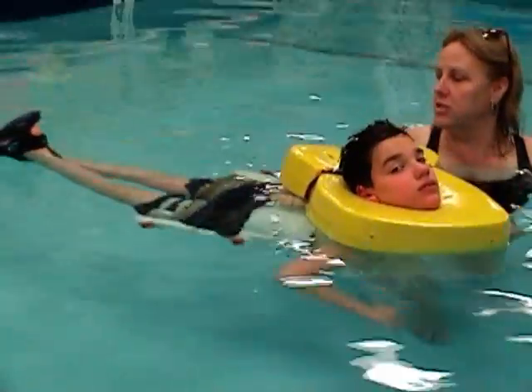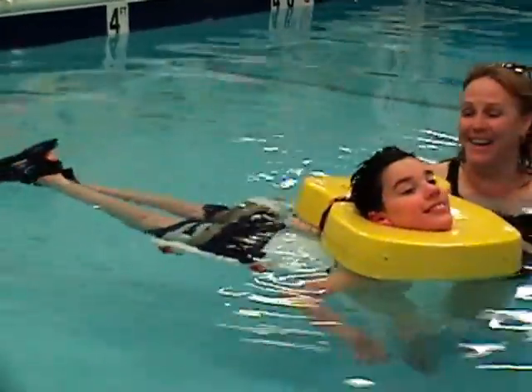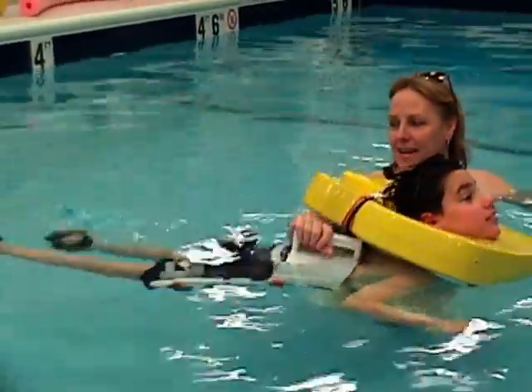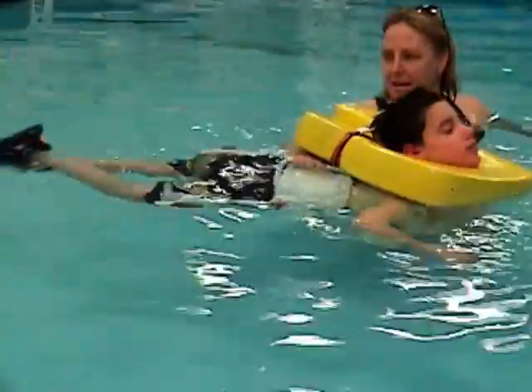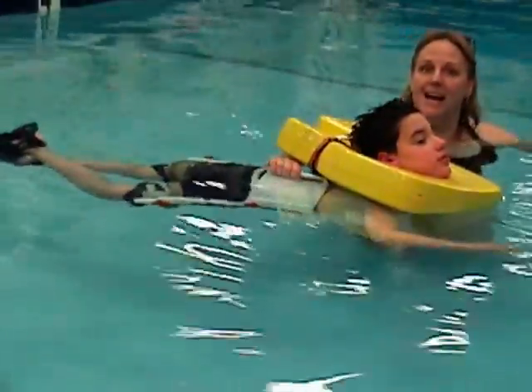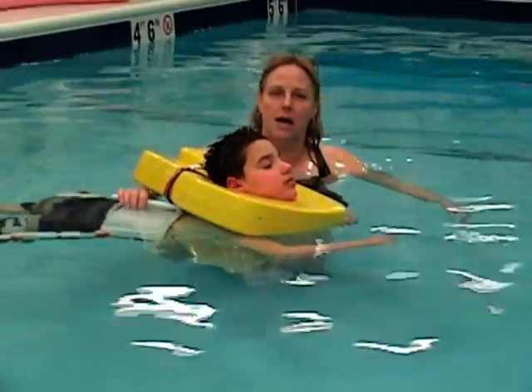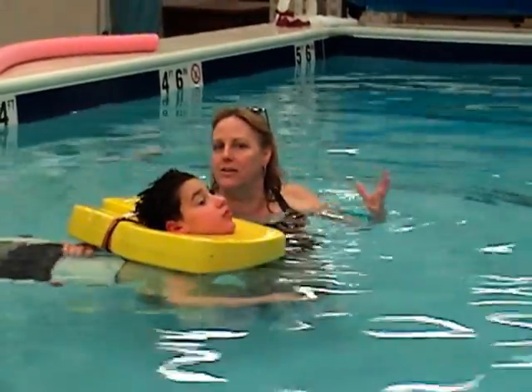One leg at a time — just your left. That's your left. And your right. That's a good kick with your right. Okay, how about your left again? Nice job. How about your right? Try again. And he's moving his arms too — it's so cool. His arms are a lot more relaxed in this. Do you notice? I think it's helping give him a little bit of buoyancy, so he's much more relaxed. He's not holding on to the neck collar.